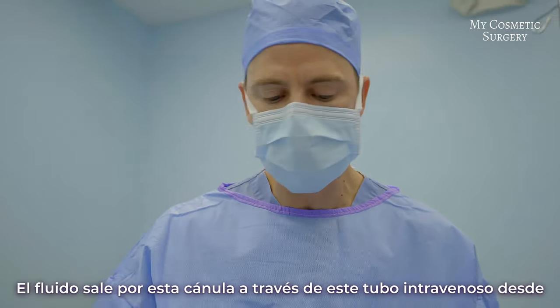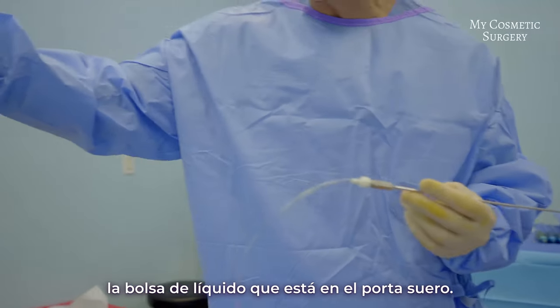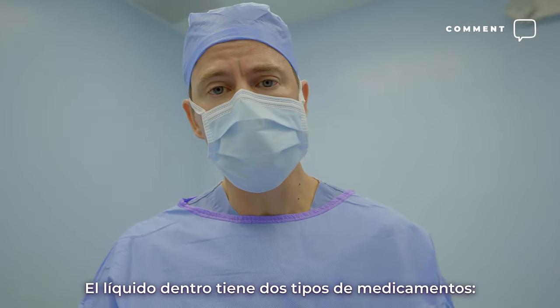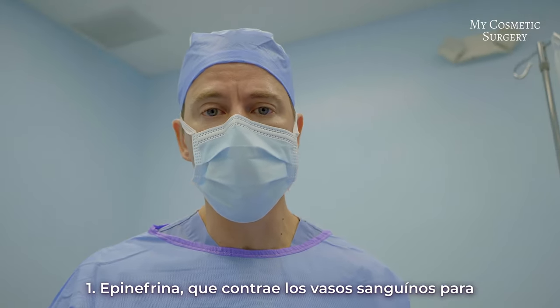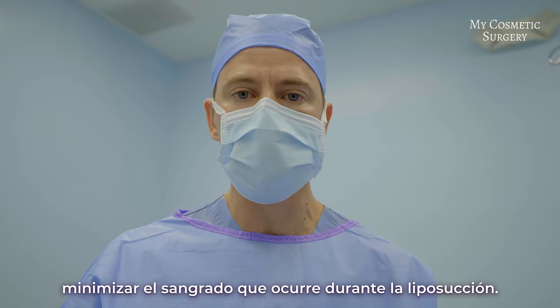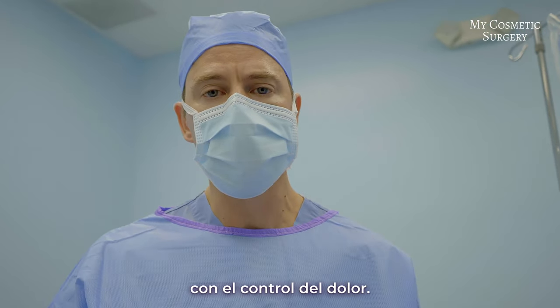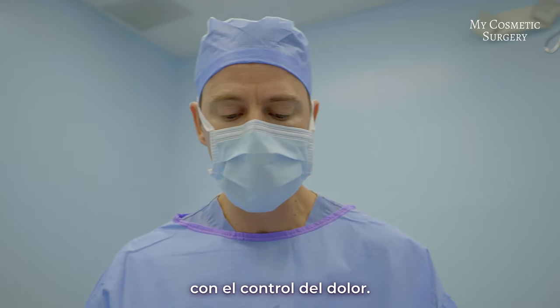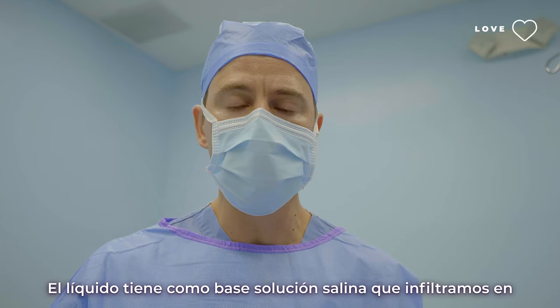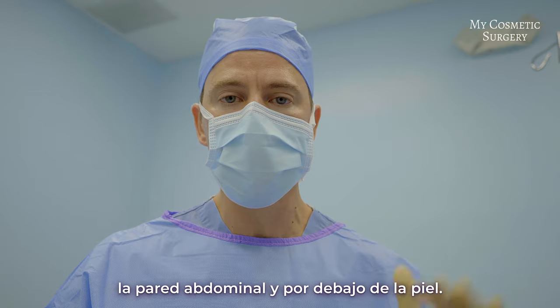The fluid, as you can see here, comes out through this cannula and through this IV tubing. The bag of fluid is there on the rack. The fluid itself has two different types of drugs in it. One is epinephrine, which squeezes the blood vessels so we minimize bleeding during liposuction. The second is lidocaine, which helps with postoperative pain control. The fluid is normal saline infiltrated through the fat tissue, which lives above the abdominal wall and below the skin.